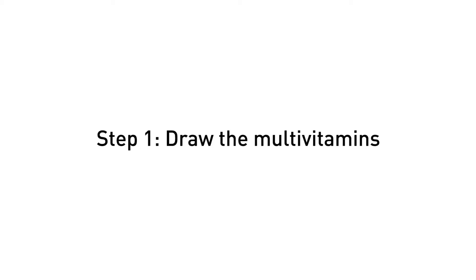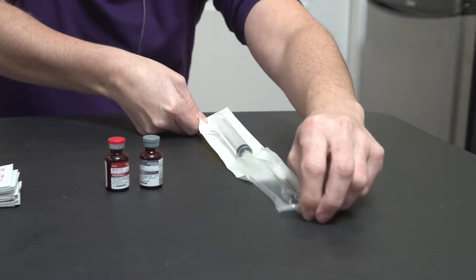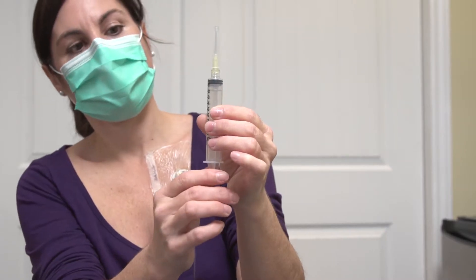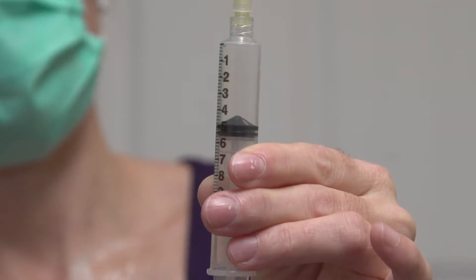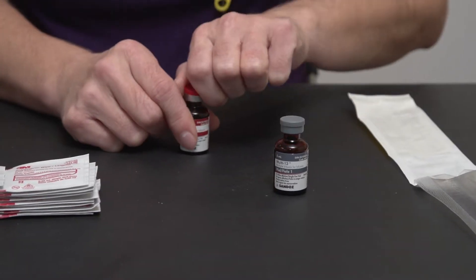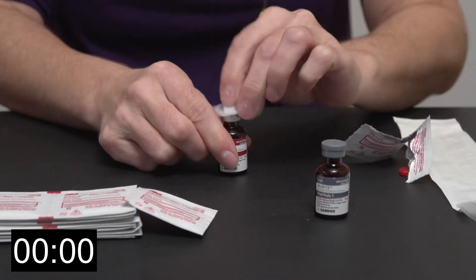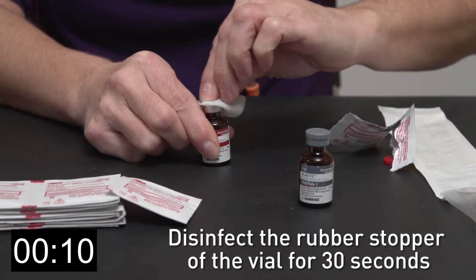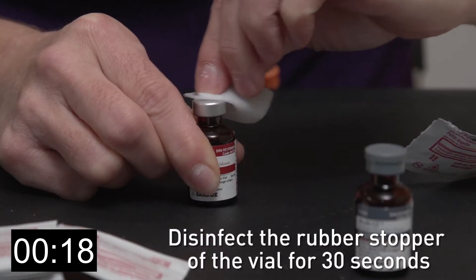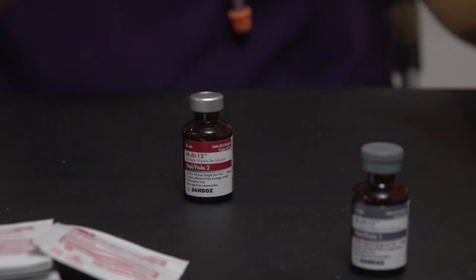The multivitamins are contained in two separate vials. To draw them, you must absolutely observe the following steps. Remove the 10 milliliter syringe from its package. Draw 5 milliliters of air into the syringe by pulling back the plunger, avoiding contact with the shaft. Place the syringe in the tray. Remove the cap from one of the two vials. Using an alcohol wipe, disinfect the rubber stopper of the vial for 30 seconds, making circular motions from the center outwards. Discard the alcohol wipe in the waste basket.